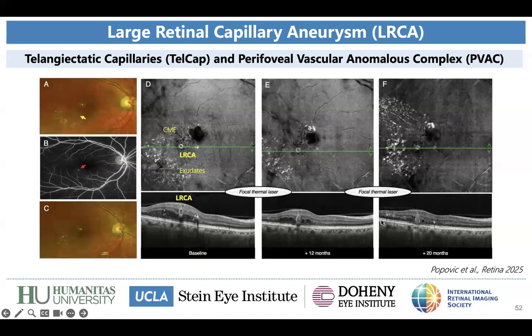And so totally agree, no need for dye injections in these patients. Also, with the injections the leakage makes it kind of fuzzy to identify some features, and with the en face, it's crystal clear.